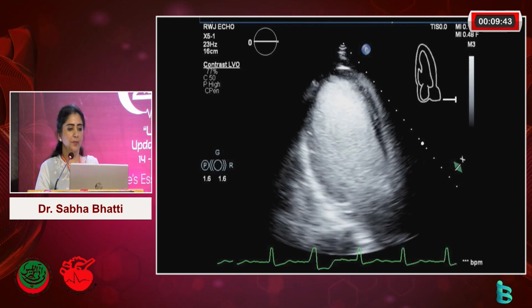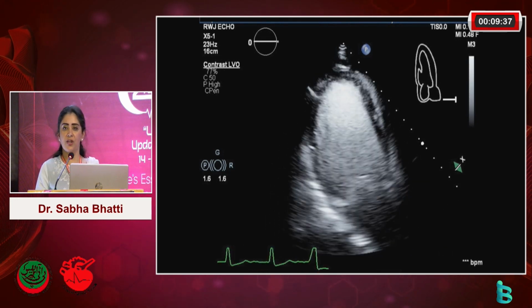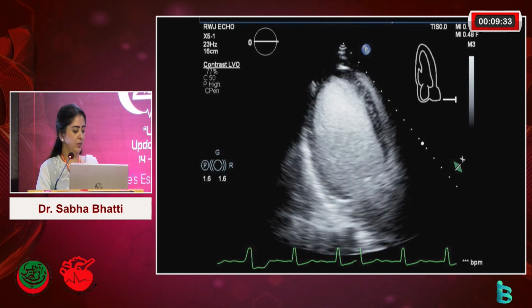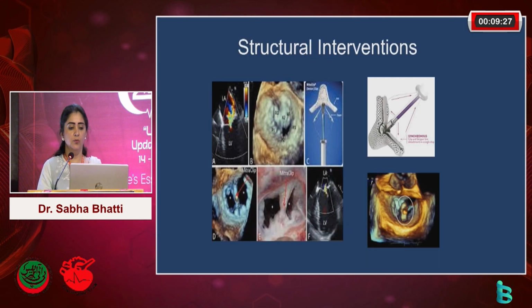And these are images that I took in my lab in the US before I moved to Pakistan. We used contrast echo very frequently if in more than 2 segments we were not able to visualize the ventricle. So if there were any 2 segments that were not visualized, we had to do contrast. So that again, as I mentioned, is something we're trying to bring.